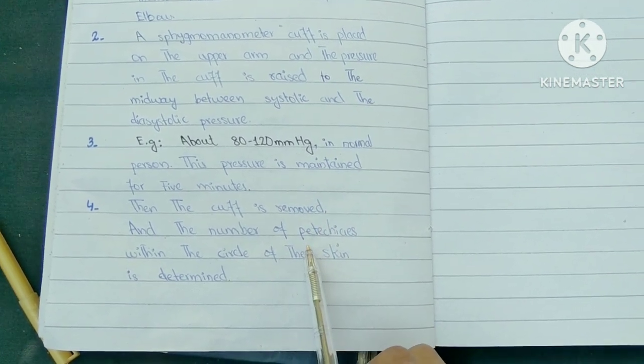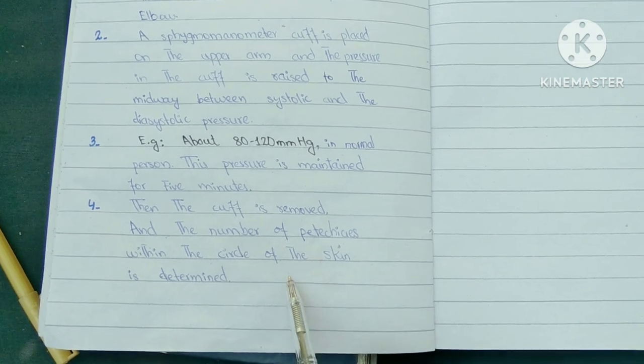Fourth, then the cuff is removed and the number of petechiae within the circle of the skin is determined.